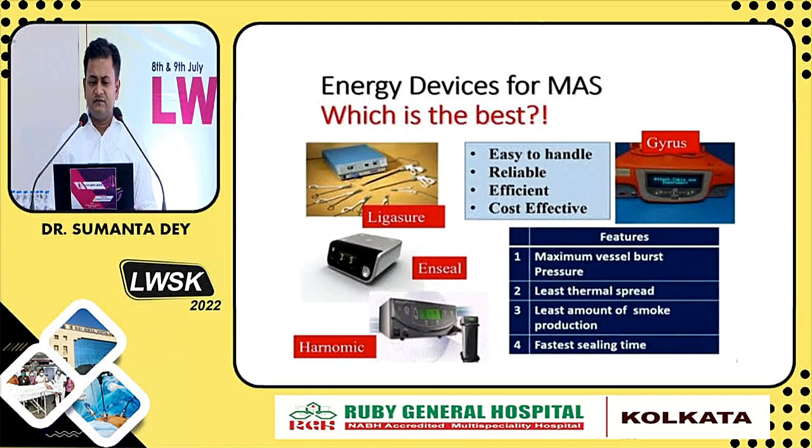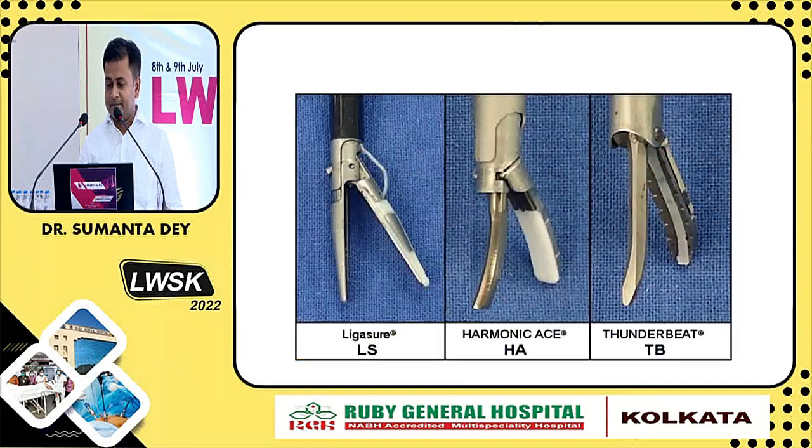So among energy devices, which is best? LigaSure, ENSEAL, Harmonic, which is best? I think you have to decide which is best: the one you can easily handle, which is reliable, which you find efficient after using it, and which is cost effective. The ideal energy source should have maximum burst pressure, at least 3 times the systolic blood pressure, then the least thermal spread, the least amount of smoke production, and the fastest sealing time.